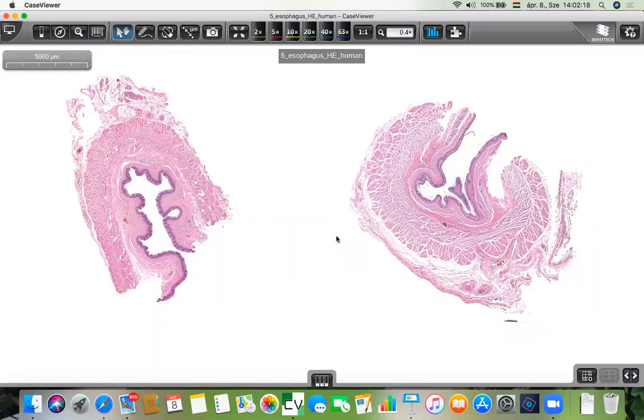It shows a different arrangement and different types of muscle cells, because the striated muscle fibers are the predominant ones in the upper portion. It's really close to the pharynx and the oral cavity. So this portion is under voluntary control, while the lower portion represents mainly smooth muscle fibers under involuntary control. Now, let's see the upper part first.